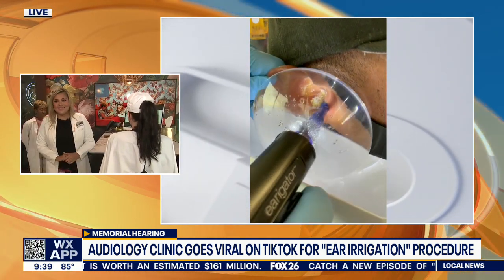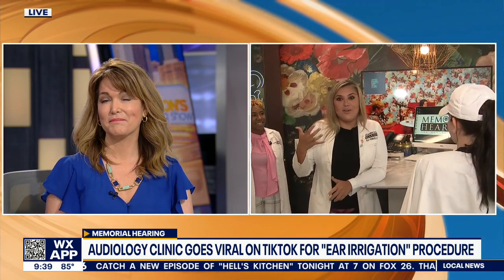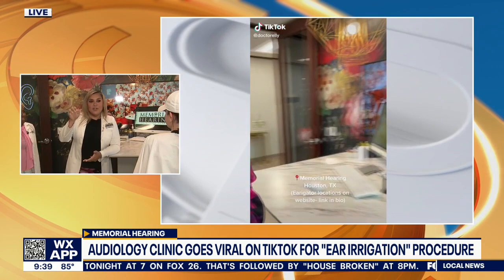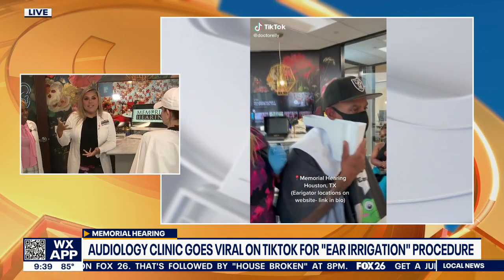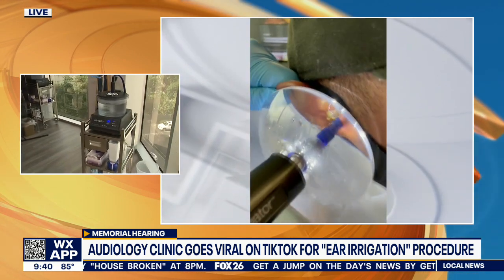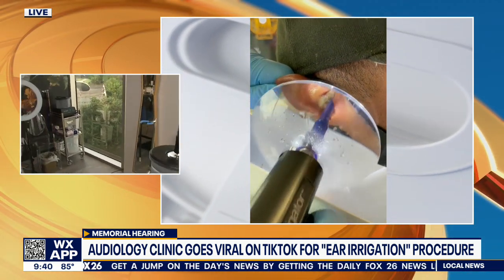So you said it's quick — how long does it take? Honestly, sometimes the wax comes out in a matter of five to eight to ten seconds, where with other methods you can sit there picking at it and suctioning it and take 30 minutes. I'm not saying it's like this every time, but for the most part it can take about 20 to 30 seconds and the biggest chunks of wax will just come right out. It's really amazing.